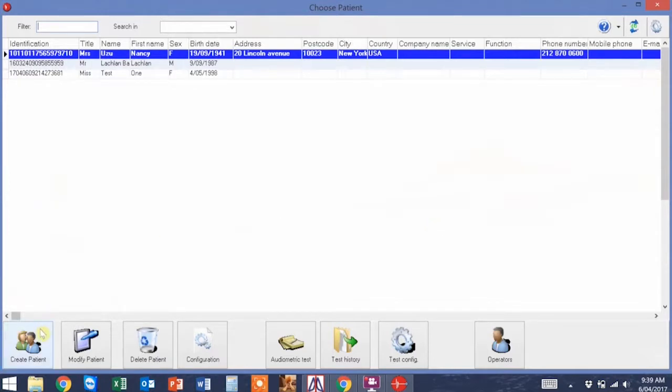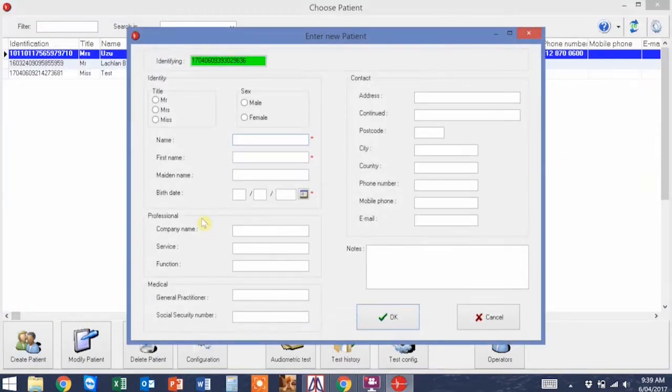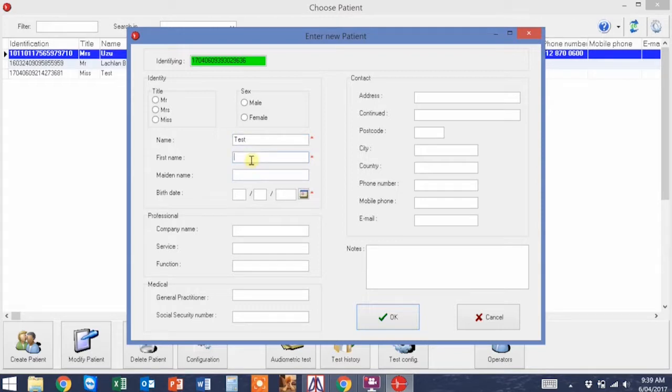Once in, create a new patient and enter the patient demographic. Once you are satisfied with this, press OK and then proceed.